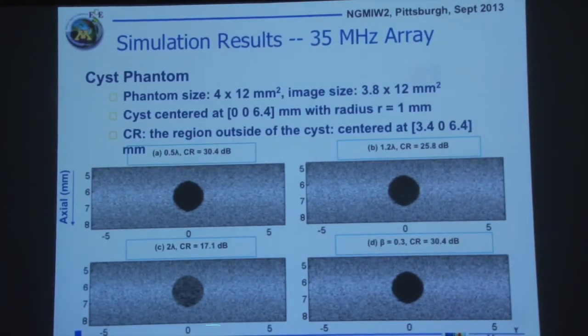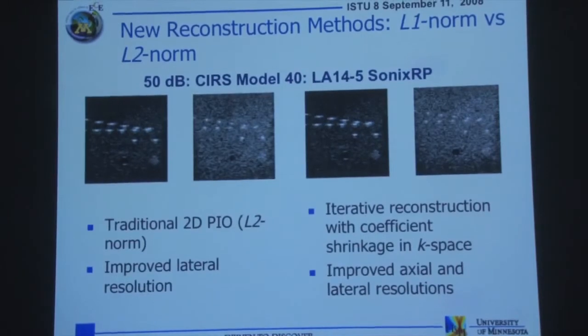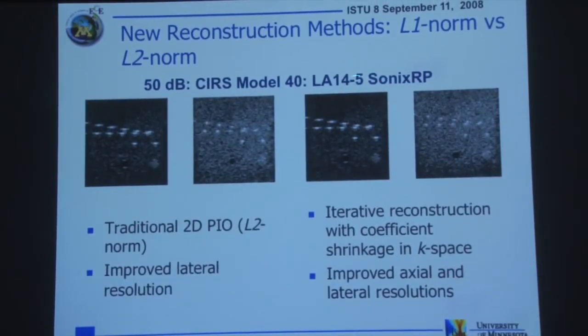I think I showed this before, but yes, this one. I hope you can see this, but this is also a very new result that I started. So taking the pseudo-inverse method that I did before, that was kind of a mean squared or least squared or L2 type minimization, I modified this approach recently to account for what people call shrinkage in the k-space. So instead of just simply using a single regularization parameter in k-space, we can actually be selective and remove certain frequency components. So this is designed to go with this adaptive refocusing scheme that I'm talking about.